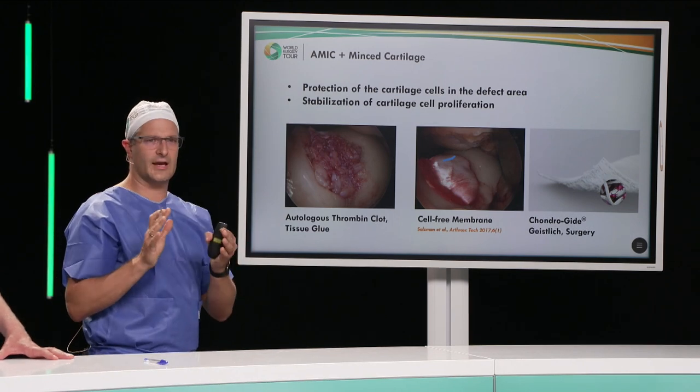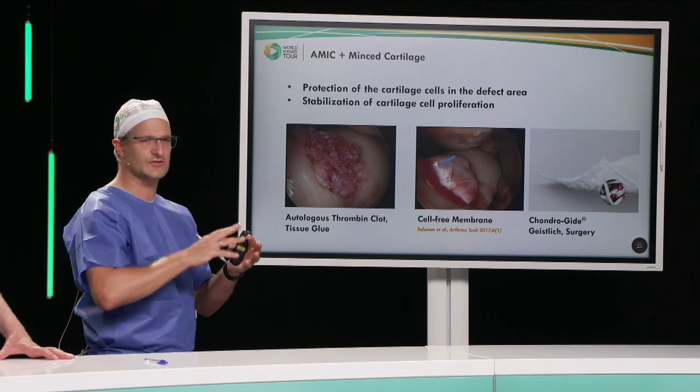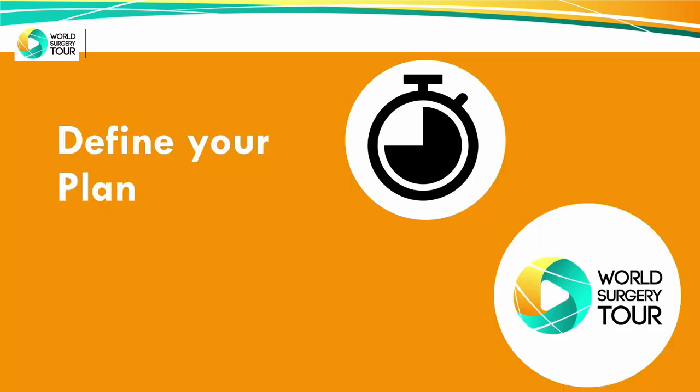Why do I want to add a membrane to the cartilage? Because this cartilage obviously needs to stabilize and it needs to have some kind of protection. The membrane is an ideal possibility to contain the cells, to protect the cells, to make sure that the healing will progress in a timely fashion and provide an ideal new, full cartilage surface.